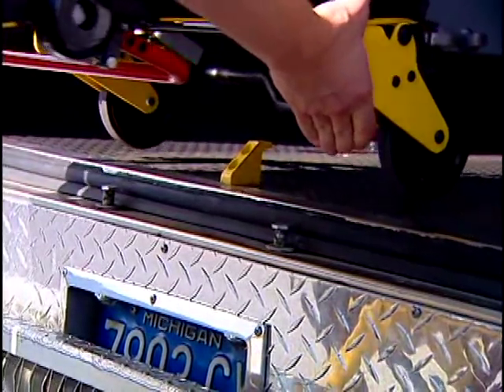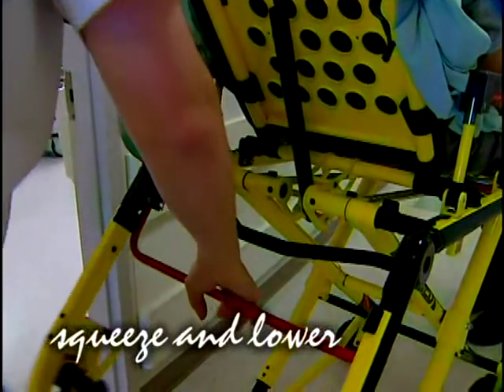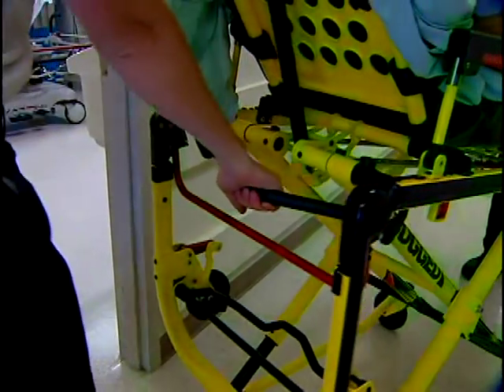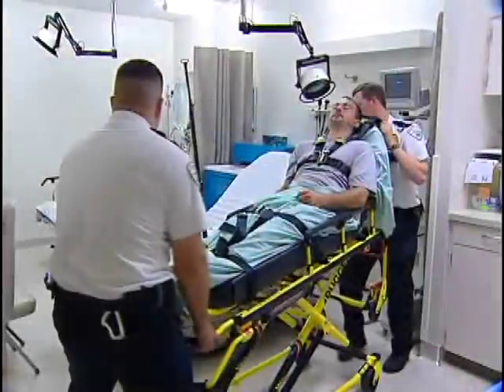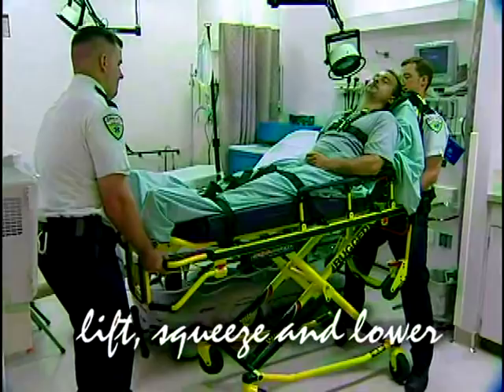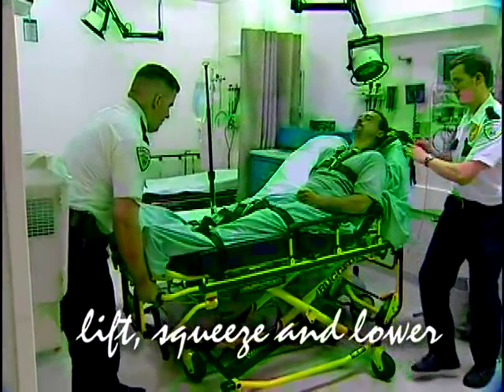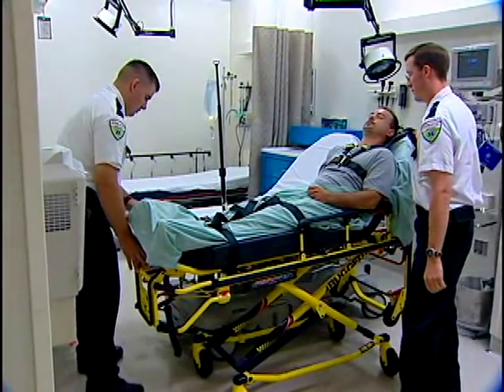Disengage the safety bar and move the cot away from the ambulance. To lower the cot with the head section broken down, the head end operator using the optional base lift bar and the foot end operator lift the cot slightly. The foot end operator squeezes the height adjustment release handle and they lower the cot to the desired height. Stay above the fifth height position — that prevents the head section from coming to rest in the casters.